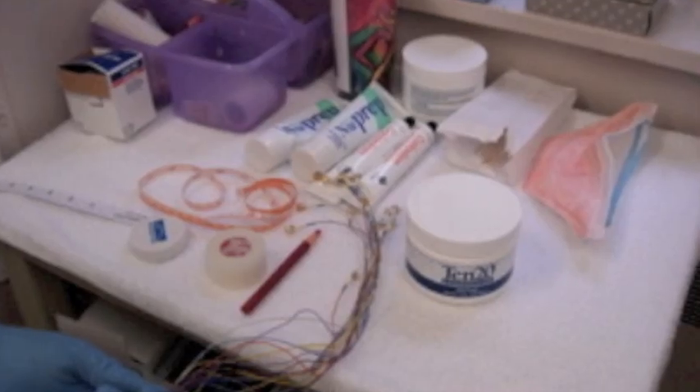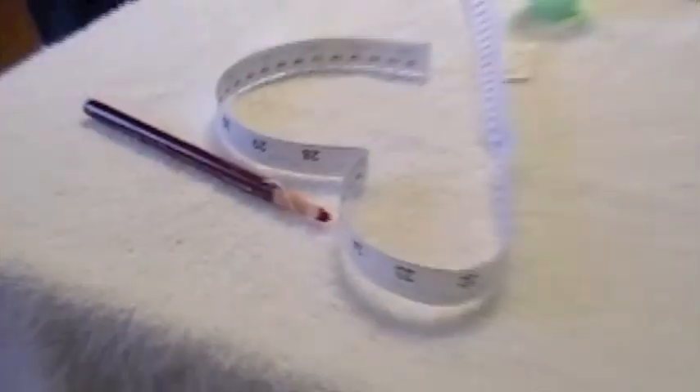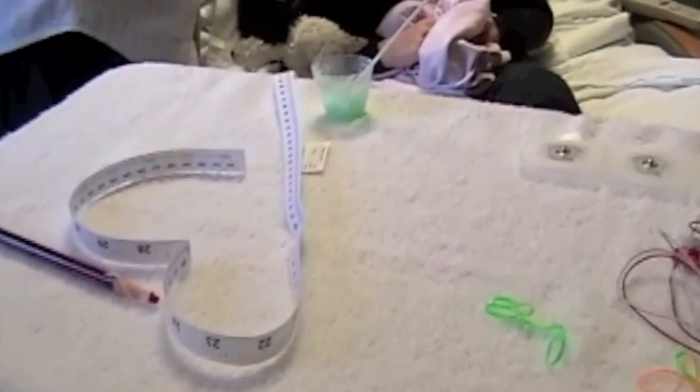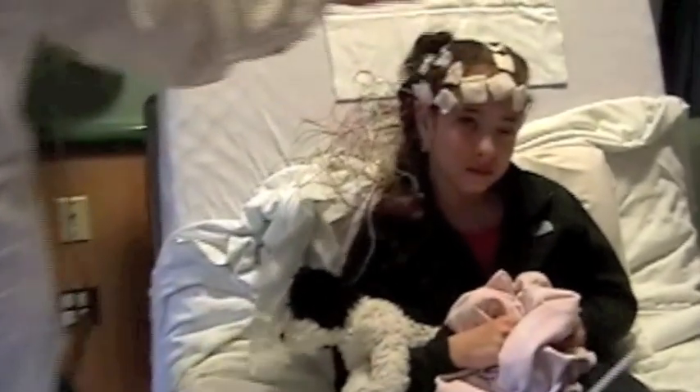Here is some of the medical equipment that you will see when you are getting your EEG. The round circles are called electrodes, and those are attached to wires which will be connected to your head to help the doctor measure your brain waves. The measuring tape and red pencil will help the technician know where to place the electrodes. The green gel will help the electrodes stay in place on your head. Ask the technician or child life specialist if you would like to see these before your test.